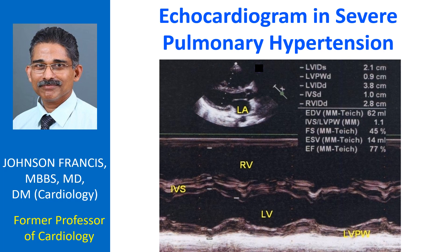The M-mode measurements displayed include: IVS (interventricular septum), LV (left ventricle), LVPW (left ventricular posterior wall), LA (left atrium), LVIDS (left ventricular internal diameter systolic), LVPWD (left ventricular posterior wall diastolic), LVIDD (left ventricular internal diameter diastolic), and IVSD (interventricular septum diastolic).